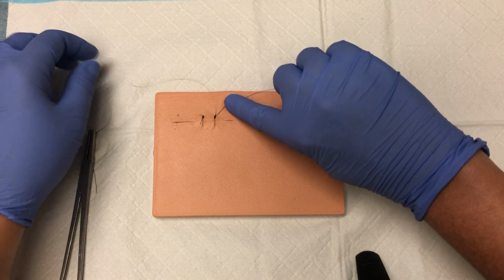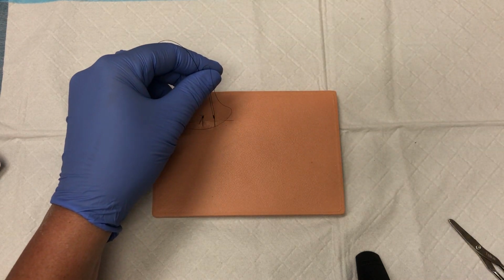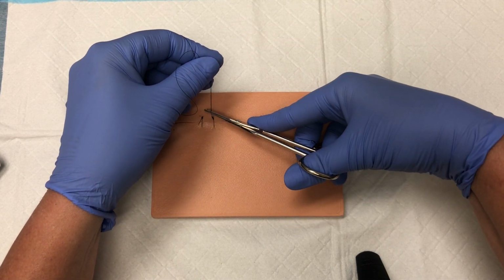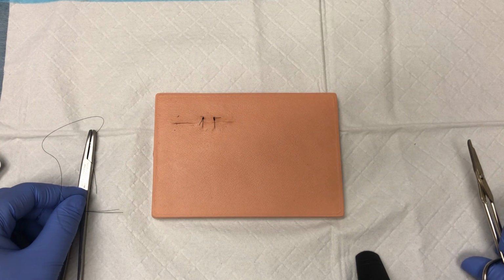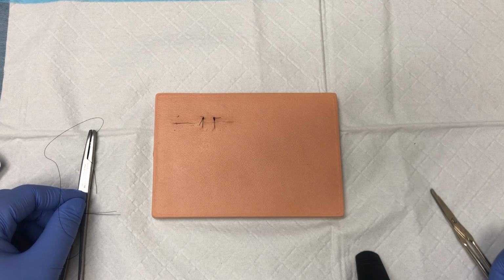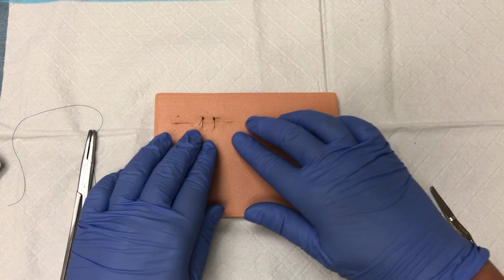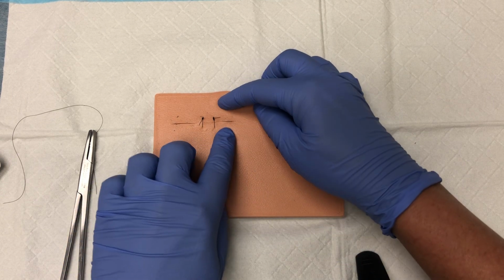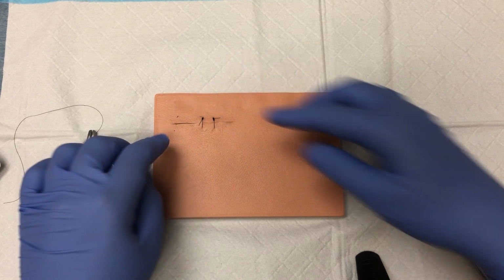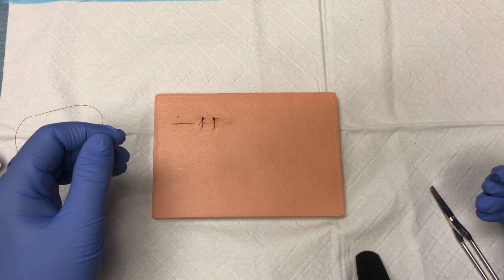And again, please try to ensure that your knots remain on the same side for your patient. It cosmetically looks better for your patient, but it also just makes it easier when either yourself or a colleague needs to remove these sutures. You would place additional sutures. I would probably place 1 additional suture here, as well as 2 on this side, and that would allow for 5 sutures total. That would be appropriate.